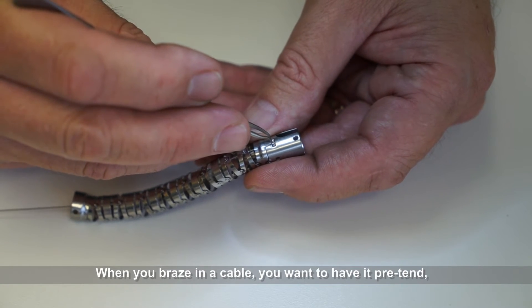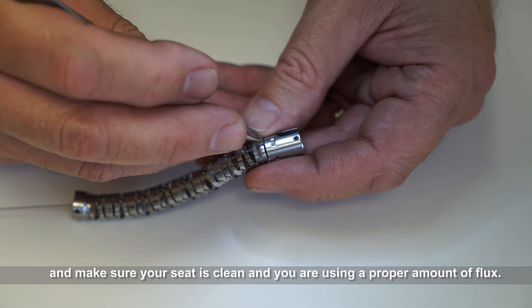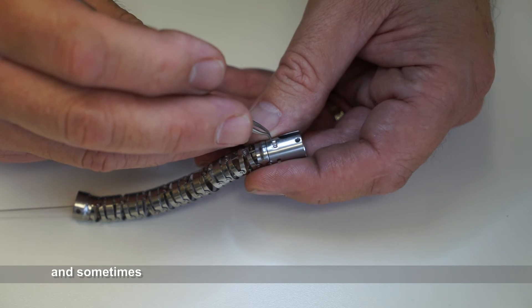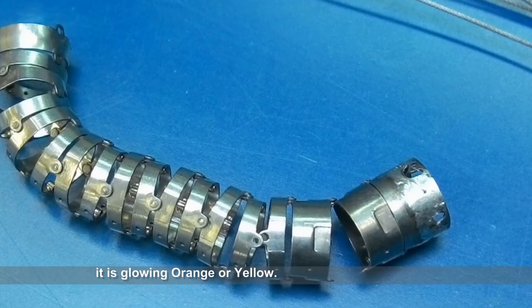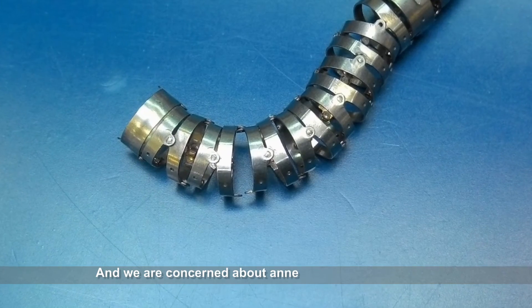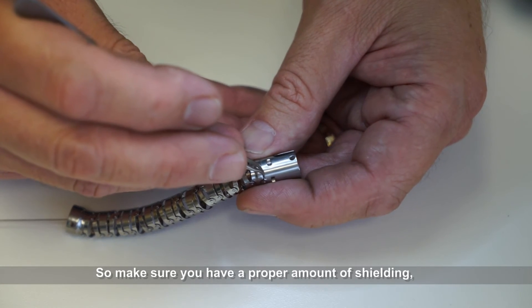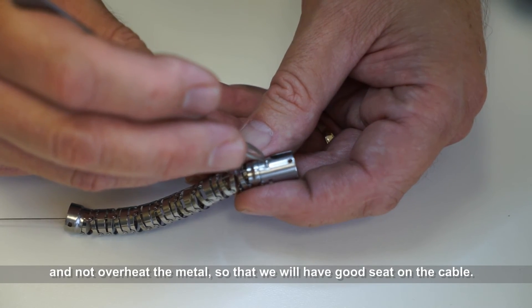When you're brazing in a cable, you want to have it pre-tinned, make sure your seat is clean, and use a proper amount of flux. Some people have oxyacetylene, butane, or propane — all kinds of different heat sources. Sometimes they get a little exuberant and get too hot. The metal will get to the point where it's glowing orange and yellow, and at those temperatures you're actually annealing the metal — especially the rivets. Those rivets will soften and you'll have a premature failure. So make sure you have a proper amount of shielding and do not overheat the metal so you have a good seat on the cable.